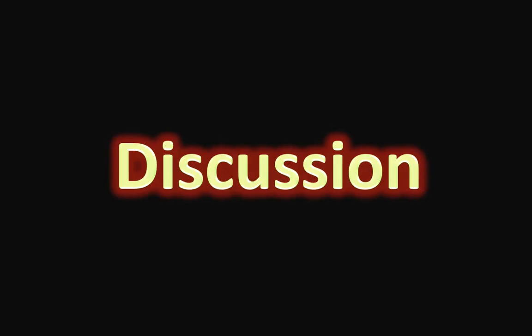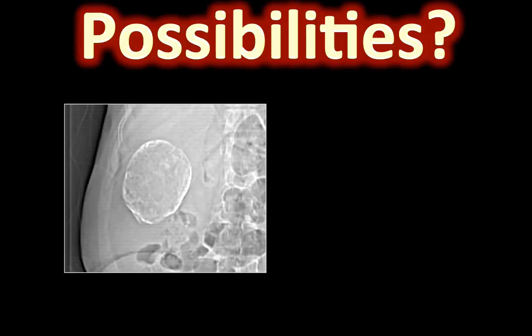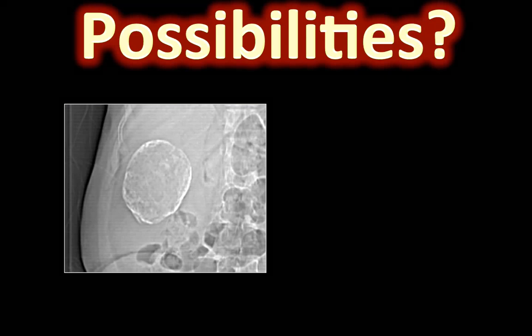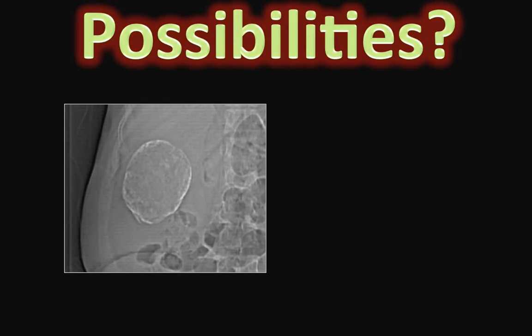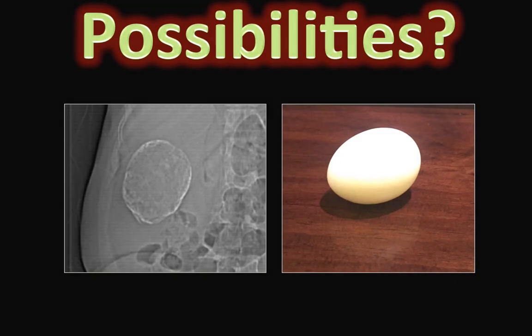Now to the discussion. The abnormality is obvious. There is an abnormal density located in the right upper abdominal quadrant. The density of this lesion is equal to that of bone, suggesting calcifications. Looking at the abnormality, you'll notice that it simulates the appearance of an eggshell — this is what we call in radiology eggshell calcifications.